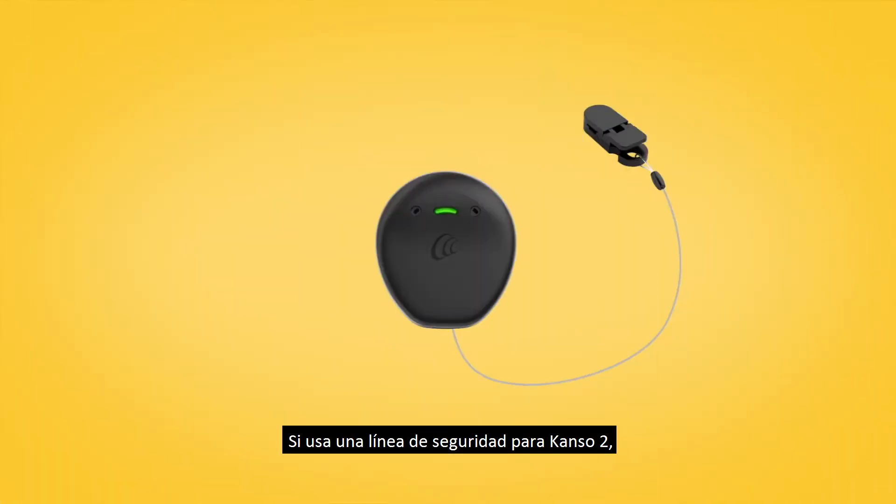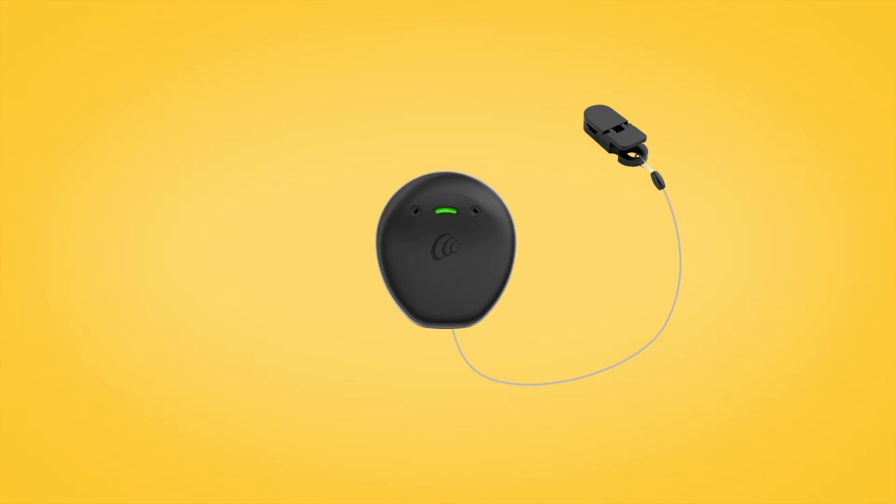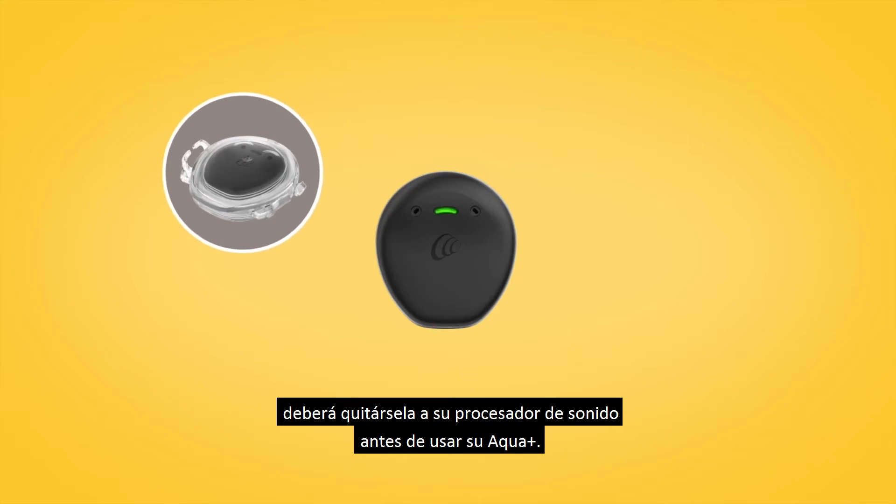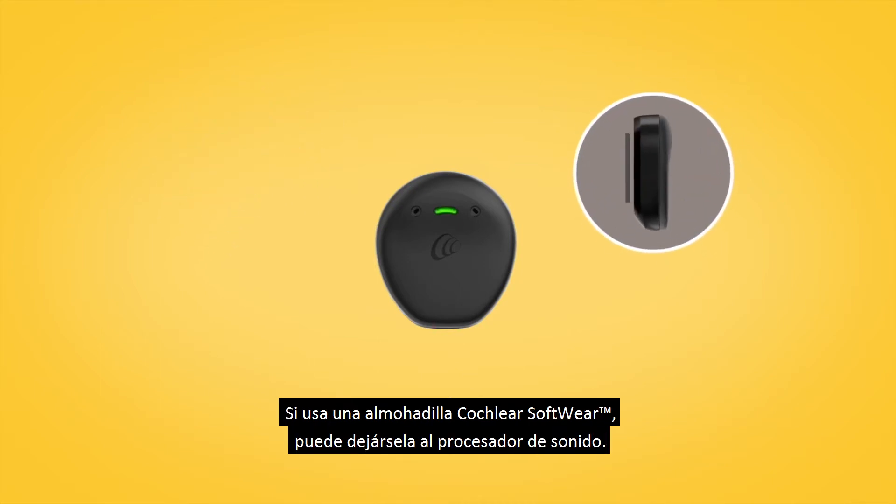If you use a Canso 2 safety line, you'll need to remove it from your sound processor before using your Aqua Plus. If you use a Cochlear softpad, you can leave it on your sound processor.